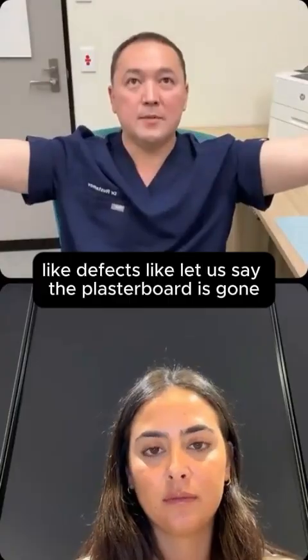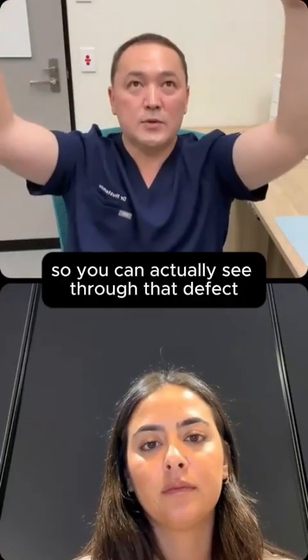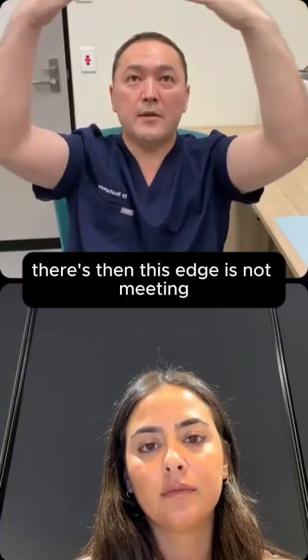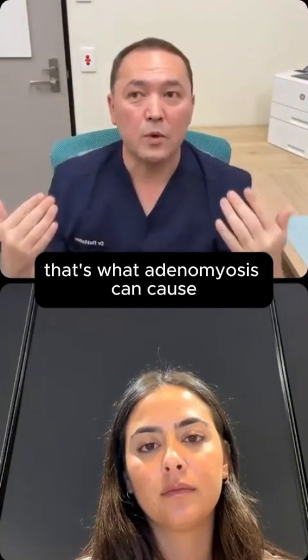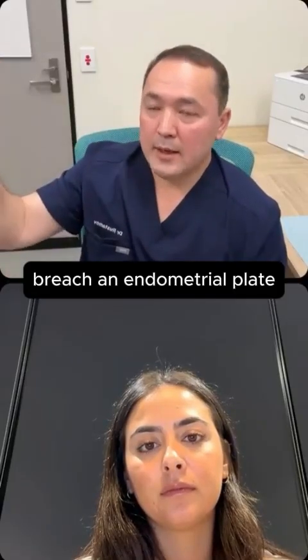Like, let us say the plasterboard is gone, now you have got a defect. So you can actually see through that defect. You have a white line of endometrium coming, then there's nothing. Then this edge is not meeting, then you have got a defect, which is just muscle layers exposed. That's what adenomyosis can cause, a breach in the endometrial plate.